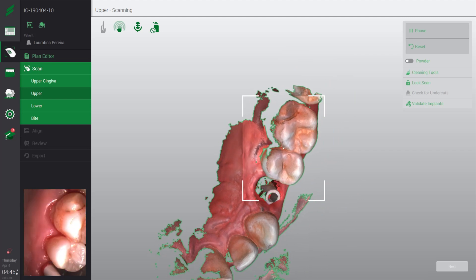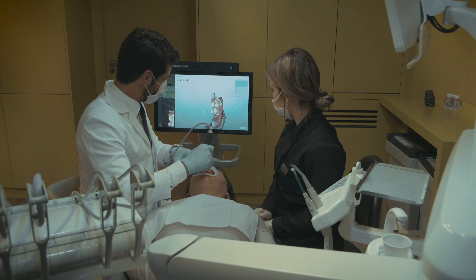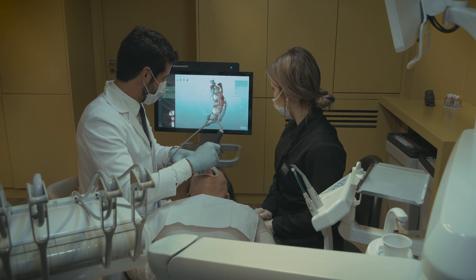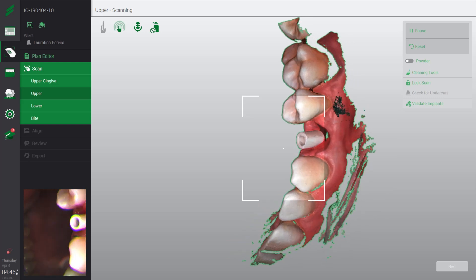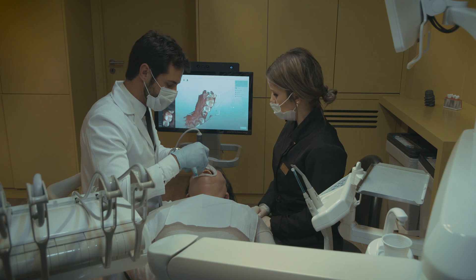As you can see, we can see the scan body very clearly. The definition of the image is very clear. And because the handpiece is easy to manage — it's very small — it is comfortable for the patient.